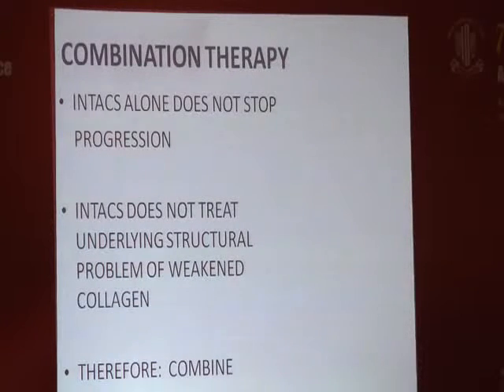You can also do a combination of cross-linking and phakic lenses, where you do cross-linking, stabilize the cornea, wait for 3 months or 6 months, and then once the stabilization has been proven, you go in and put either a toric ICL or a normal ICL, depending on the patient's refractive health.